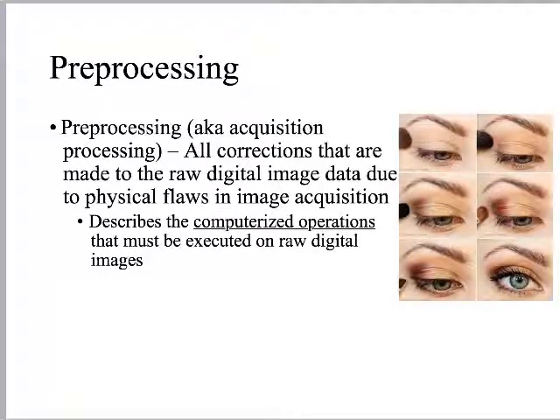But now with digital, we can window and level all day long. We can apply measurements. We can even change the lookup table that's being used to process the information. But the major ones that we mess around with are brightness and contrast adjustments. So we will call those post-processing. So windowing, window width and window level, that's post-processing.